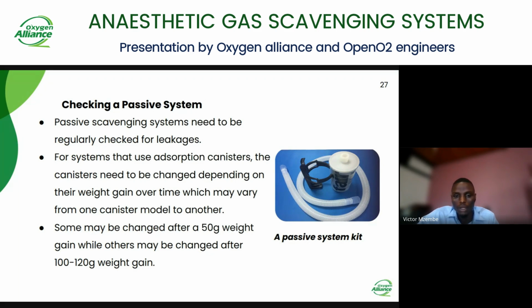Some canisters might need to be changed after they have gained a weight of 50 grams, because as anesthetic gas is being collected in the canisters, the weight of the canister changes. So after a 50-gram weight gain, they have to be changed. Others may need to be changed after 100 to 120 grams of weight gain. However, it should be noted that it is recommended that the canisters be changed every 12 hours of the treatment operation.